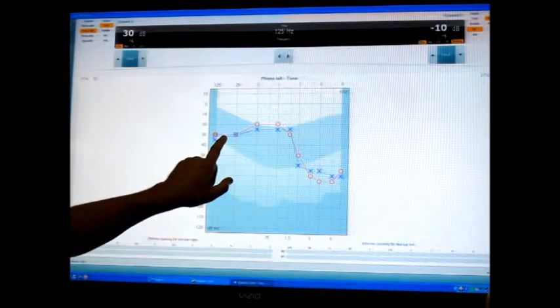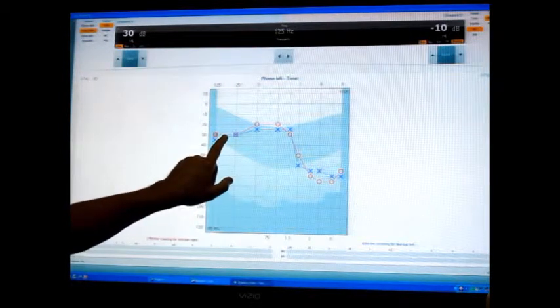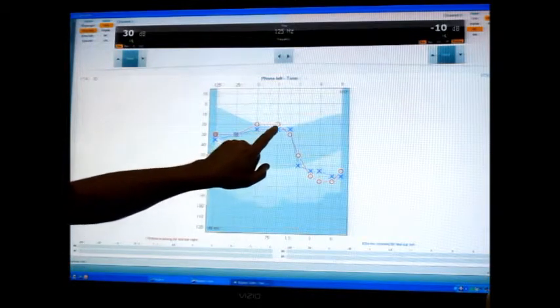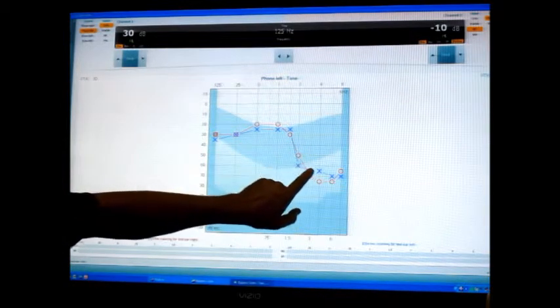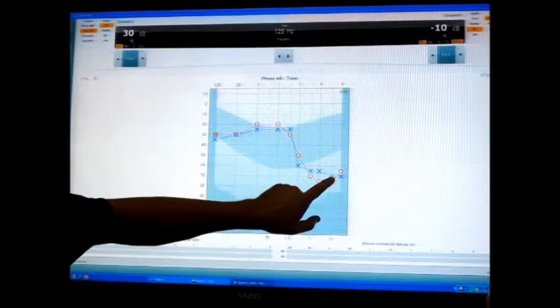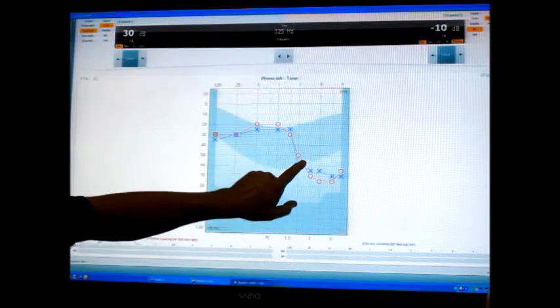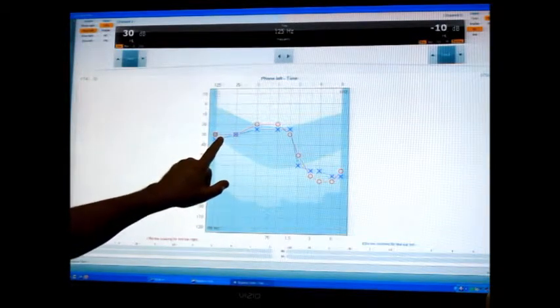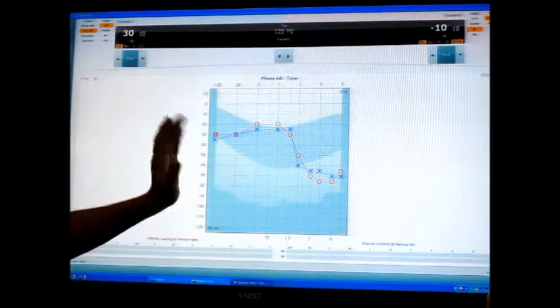The first thing that we notice right off the bat is how similar both ears are in terms of how well they're hearing. They're not exactly the same, but the degree of symmetry is what we want to see for both ears to have a similar level of hearing.